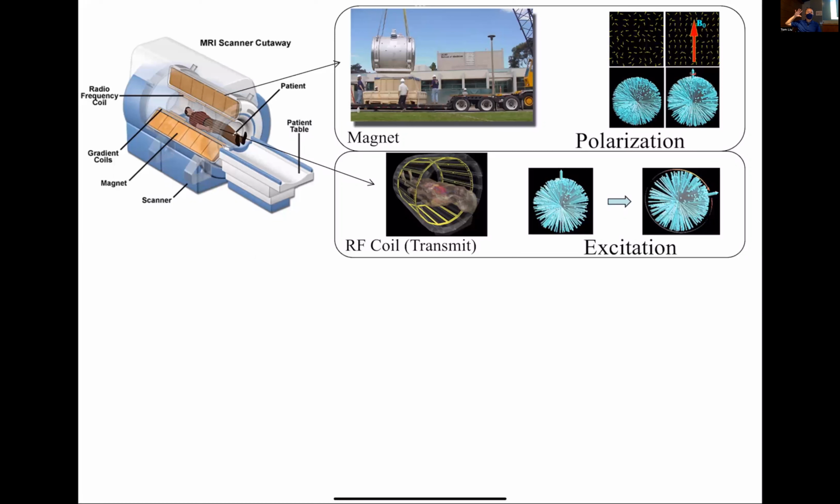So it turns out that if I can make each one of those magnets spin around, each of them is like a little antenna. And if I can get them to spin at different frequencies, now they're basically little radio stations transmitting at different frequencies, and then I can listen to it out here. That's why we excite the magnetization. We want to take it away from just being a little bar magnet to being a magnet that is going to precess around and can broadcast its location and magnitude to us. So that's why we do excitation.